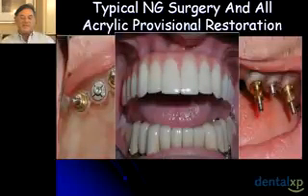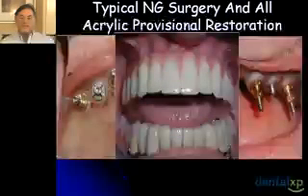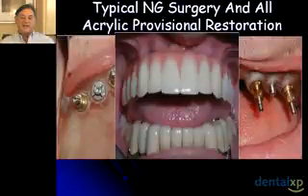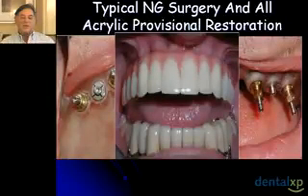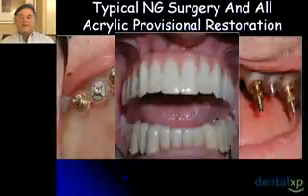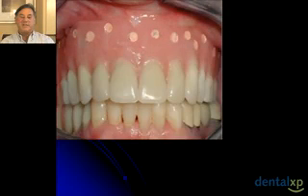If it breaks apart, we have acrylic restorations that can be replaced. If we have a need for an upgrade, the patient can have all the information digitally stored, and they could go to a teeth in an hour restoration if you want, without even having to do any impressions. However, I might recommend doing very standard restorations, or at least do an indexing to determine if the master cast is ideal. This is a case where we did the traditional or the original teeth in an hour restoration.